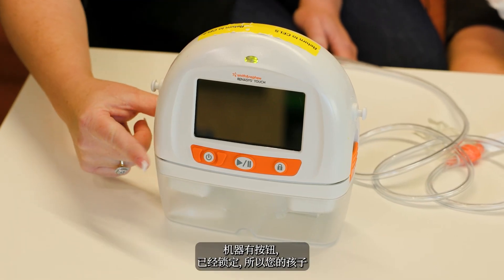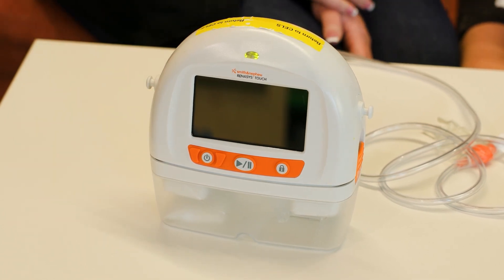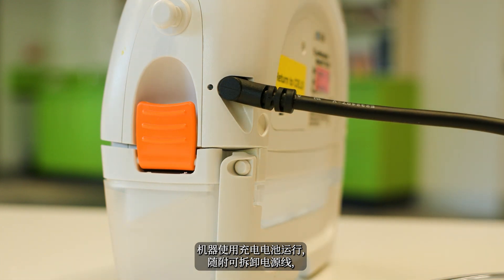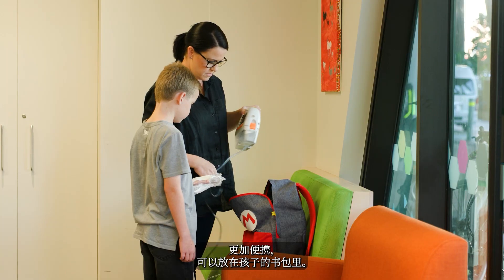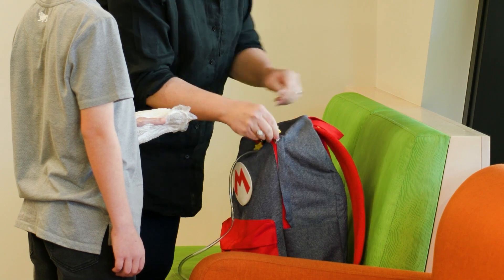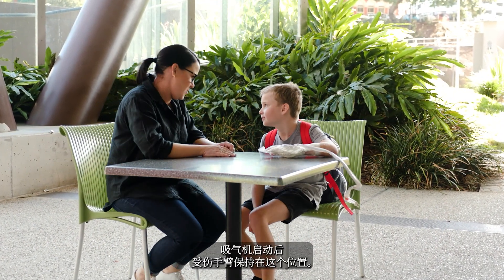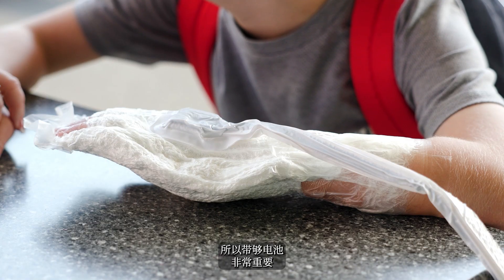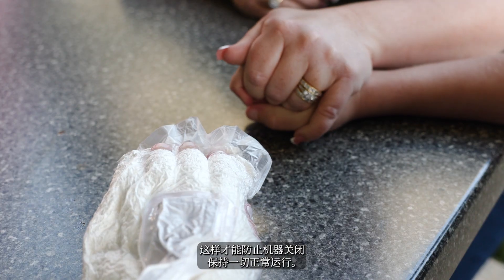The machine has buttons but they're locked so your child won't be able to alter the settings. The machine runs on a rechargeable battery which comes with a detachable power cord, so it's portable and can be placed in a child's backpack. The machine has 20 hours of life when fully charged. It's very important that there is enough battery to prevent the machine from turning off to keep everything in place.